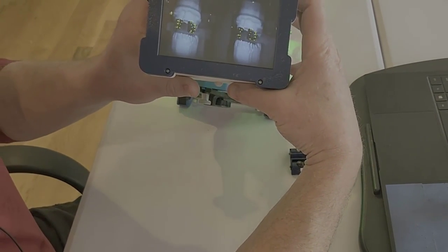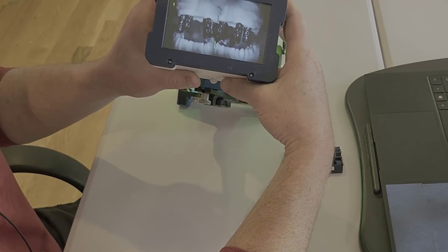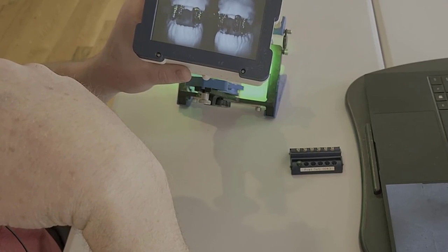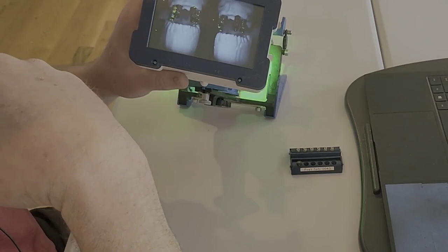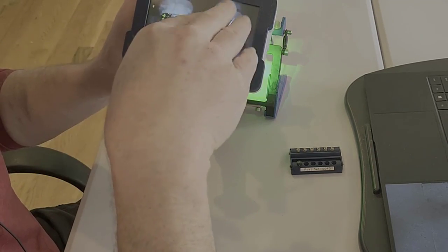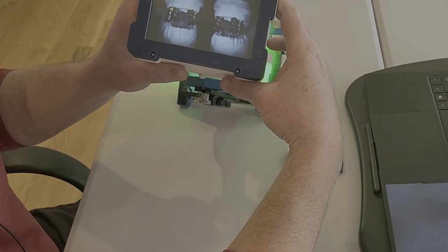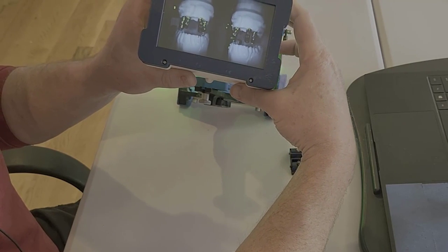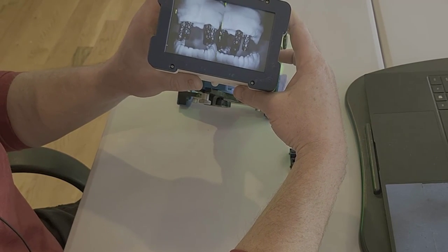All right. So real quick before I start, notice if I get too close, all of those little green dots that I was seeing on the scan bodies kind of disappear. All right. There's a sweet spot on the distance where the focal distance of the camera can pick these up. You want to have the image of the scan bodies in both sides of the screen. All right. I wouldn't want to be picking it up on one side and then not on the other. And then two, you ought to see those dots showing up pretty clearly. All right. So if you don't see them, chances are you're too close. All right. They go away.